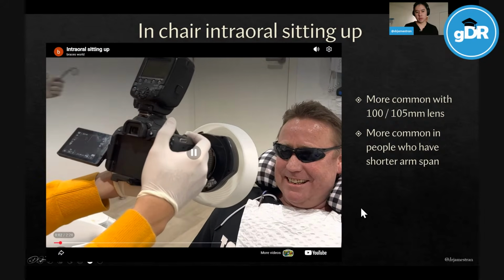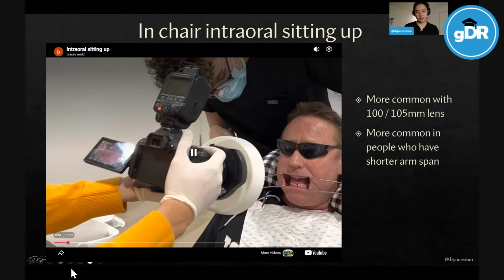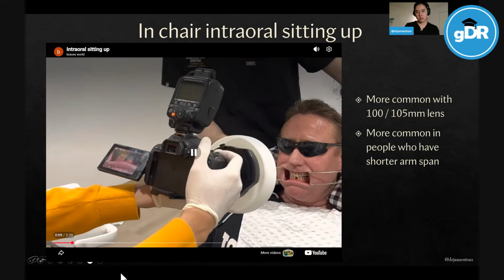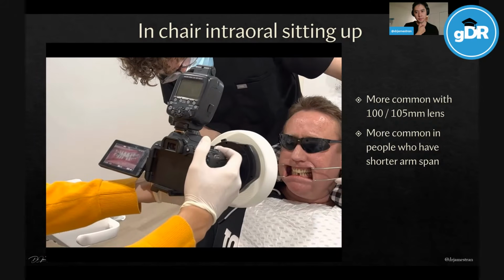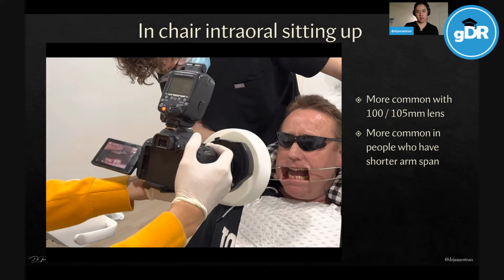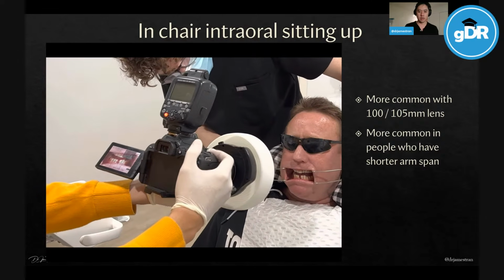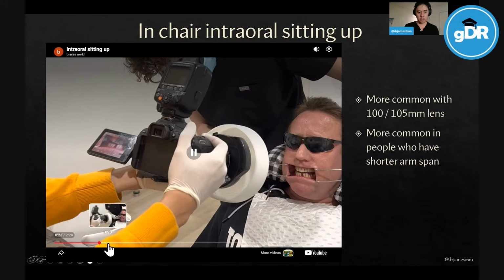So this is just an example of us taking some photos here. Ignore that I'm holding it with a glove. This is a very old video. But you can see teeth together. We've got teeth apart here. We'll take the photo there.